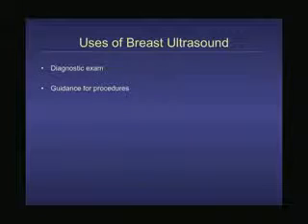So how do we use ultrasound? Well, for the most part, we use it as a diagnostic exam, all right? And I'm going to talk about different uses. It can help us guide procedures, and then sometimes we can use it as a screening exam, but that's not the primary role of ultrasound compared to mammography.